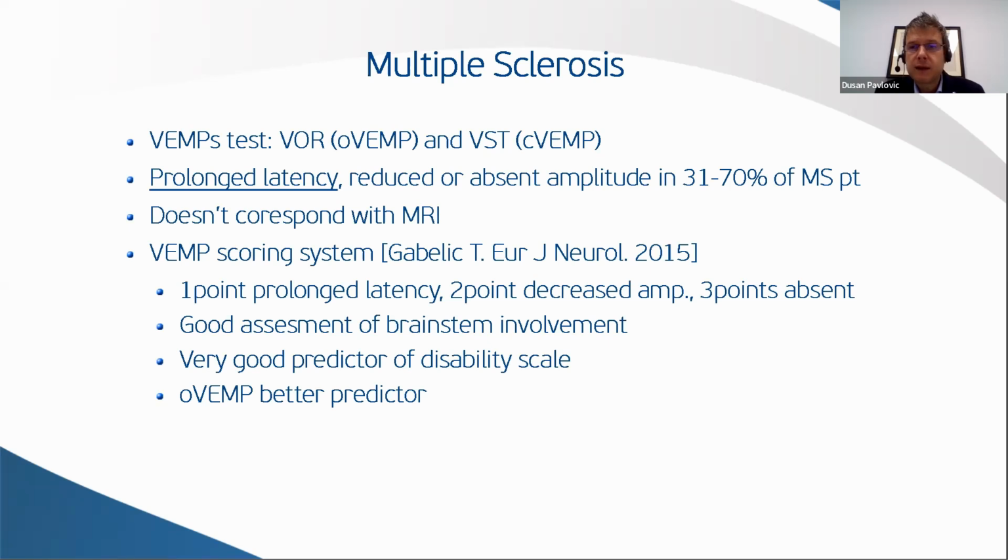Well, actually, here VEMP finds a very good clinical application. Here is a proposed and very good clinical practice scoring system: 1 point if the latency is prolonged, 2 points if the amplitude is decreased, and 3 points if absent. It is a really good predictor of a disability scale, and the same authors found that the OVEMP is a better predictor than the CVEMP.